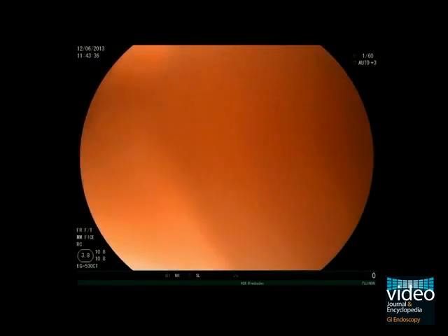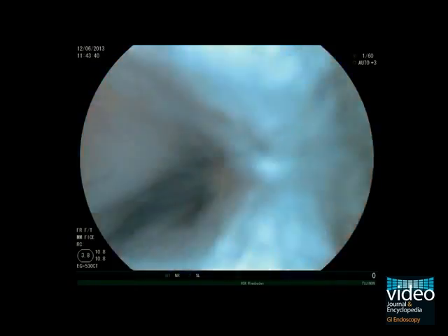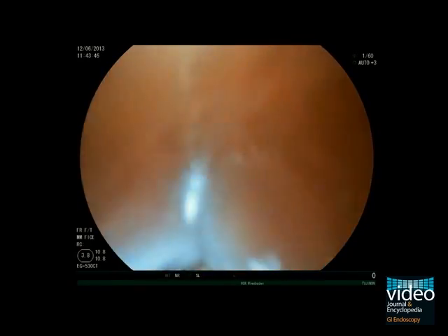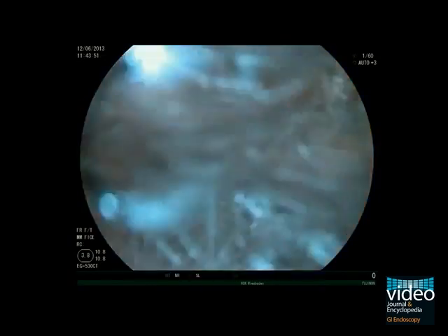In the last step, you can use acetic acid to highlight the mucosal structure. Usually, there is no need for a spraying catheter — just position the scope at the proximal end of the Barrett segment and flush the esophagus with 1% acetic acid through the working channel after aspirating the air.